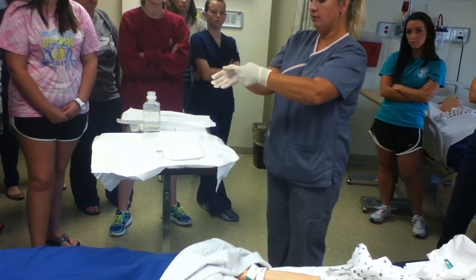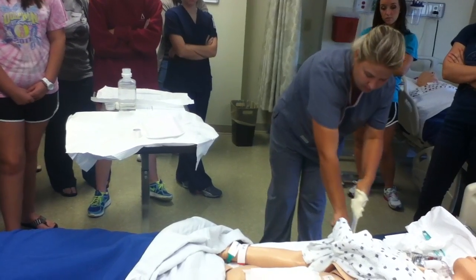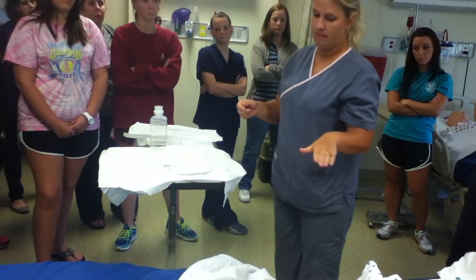Glove to glove, skin to skin, down in the trash can. Now what I need to do is tape my dressing.